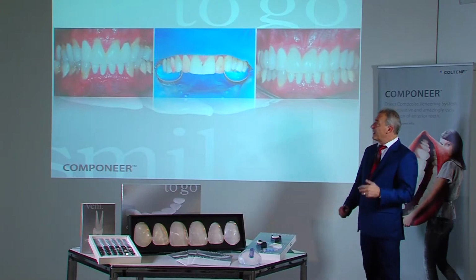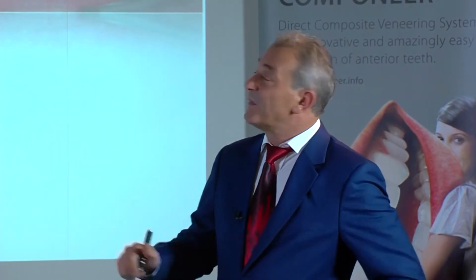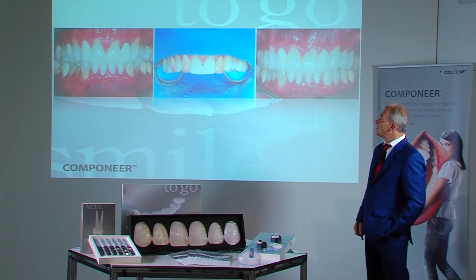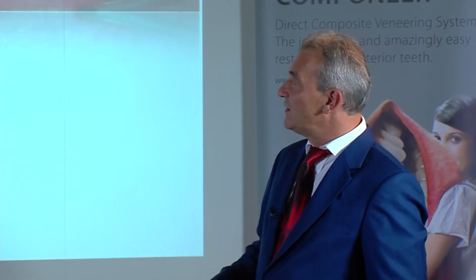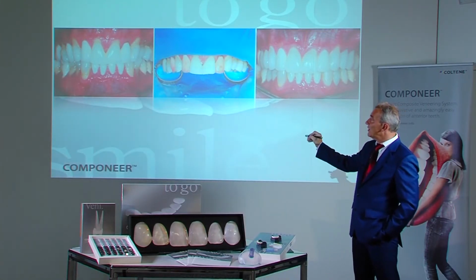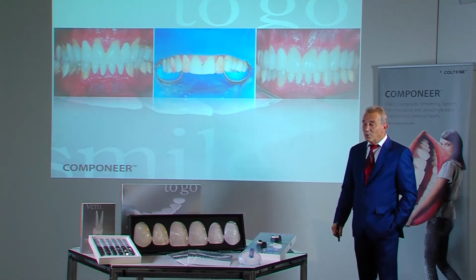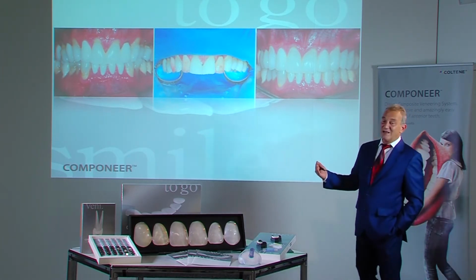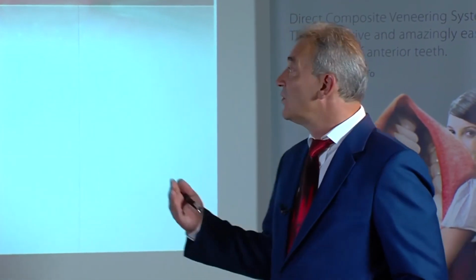The second problem is the combination of natural tooth substance and ceramic crowns, which we will discuss in greater detail in Chapter 4 on the repair of ceramics. Crowns had been provided at an earlier stage as a result of abrasion due to bruxism and erosion. You can see the lateral incisors and the crowned premolars. Nonetheless, it was possible to optically correct all teeth with componeer or reconstruct the missing sections with componeer.